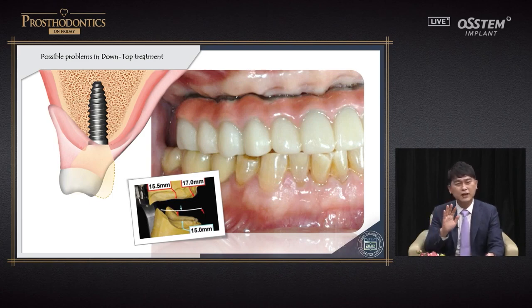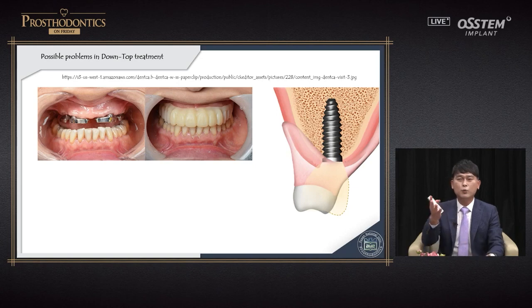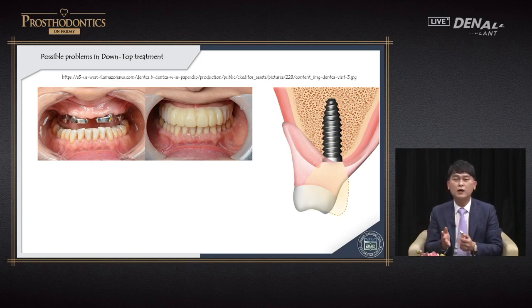I'm not saying this concept should be used at all times. When aesthetic and functional problems occur, we don't have to use a wide denture base like the existing denture base. We can think of a prosthesis with a little bit wider base for aesthetics and proper artificial tooth position.